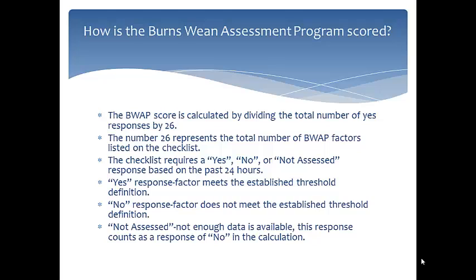A no response means that the factor did not meet the established threshold definition. And a not assessed answer means that not enough data is available. This response counts as a response of no in the calculation.